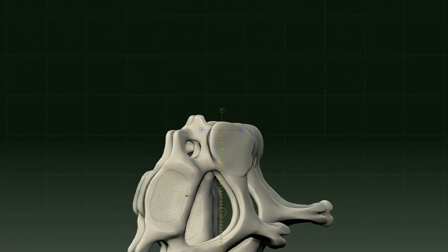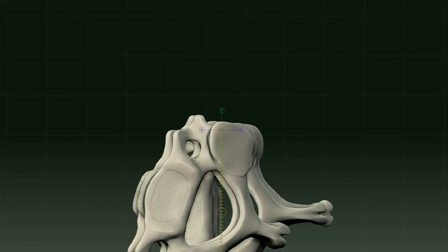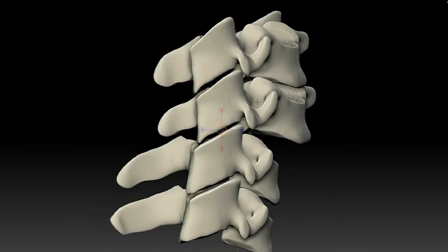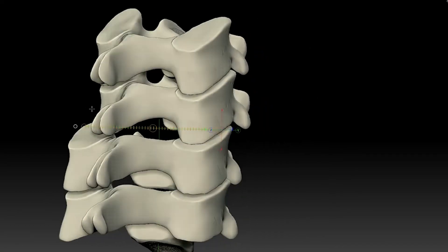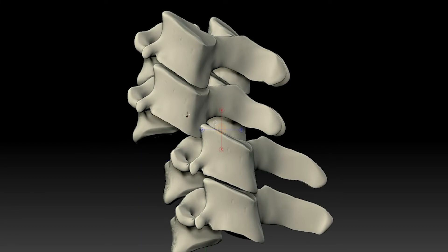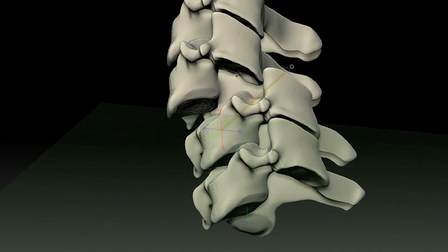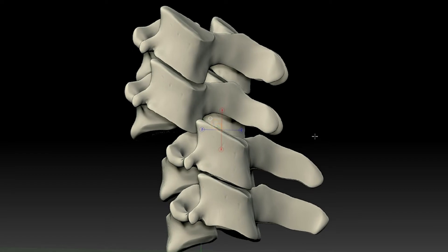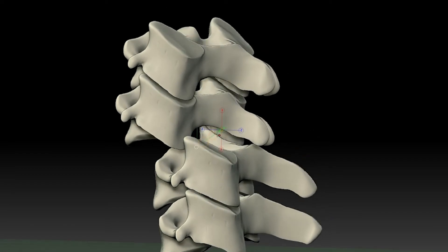If we look down here through the neural canal, you can see that the more cephalad segments are anteriorly translated relative to the levels below. And then we have this oblique view where these sets of articular pillars, which are paired, are obliqued, and then these ones are well superimposed. You'll see one group of the facets all paired, and the other ones paired up to the point of the spondy where the facet dislocation is. Then you look for that naked facet on the inferior surface, and this one sitting out here naked as well. Projectionally it can be a little difficult because it will line up with the facets on the opposite side.